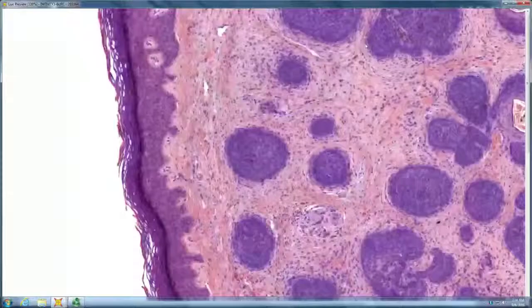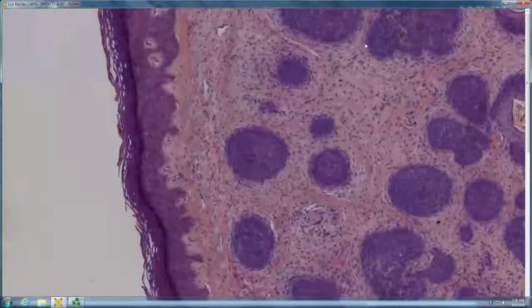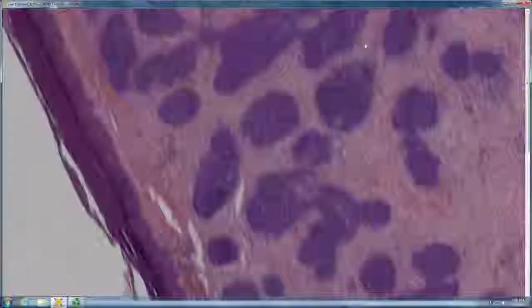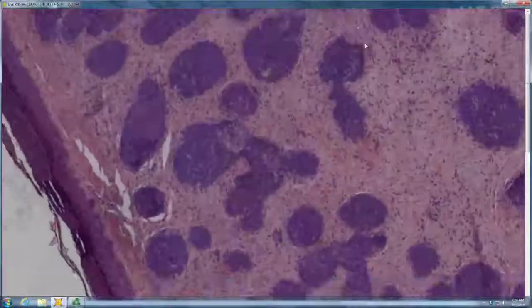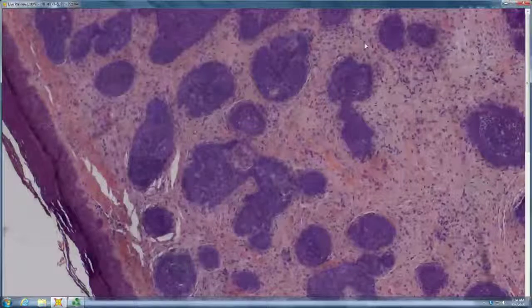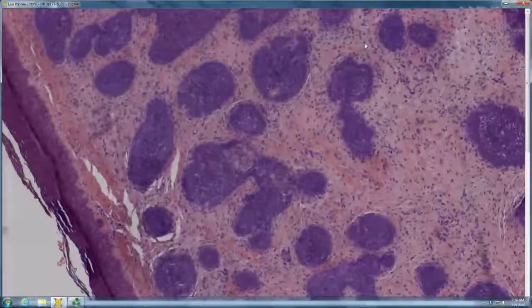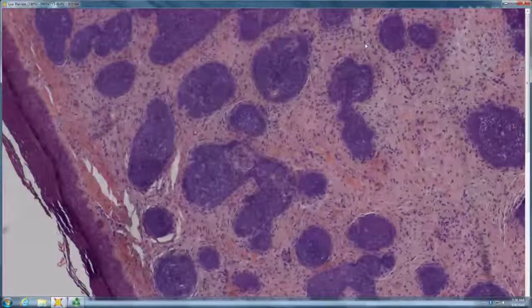No retraction space in the stroma, concentric fibroblast-rich stroma, papillary mesenchymal bodies within the stroma. So this would be, you could call it a trichoepithelioma or trichoblastoma. Trichoblastoma is the overall rubric, and then the well-differentiated ones within that are trichoepithelioma.